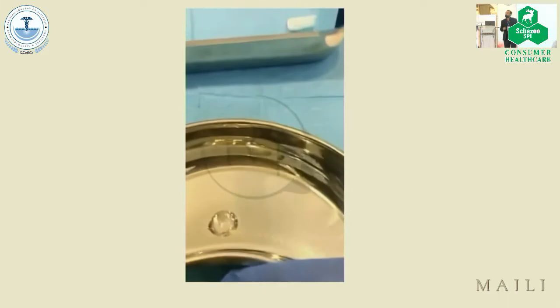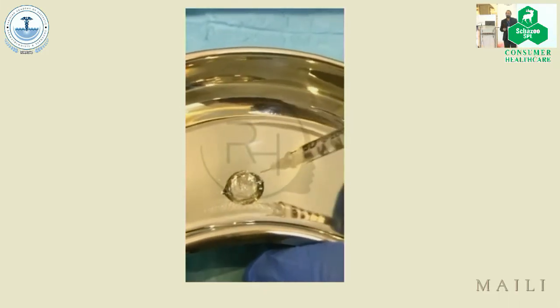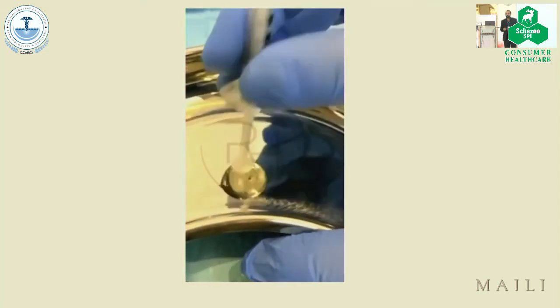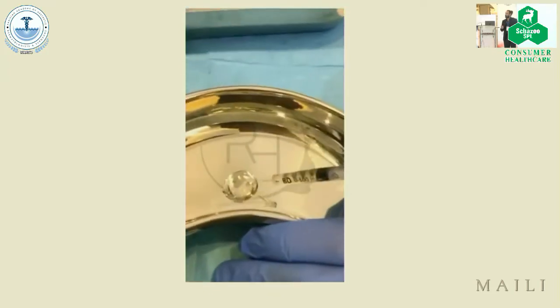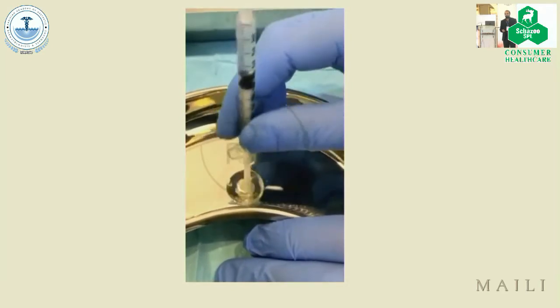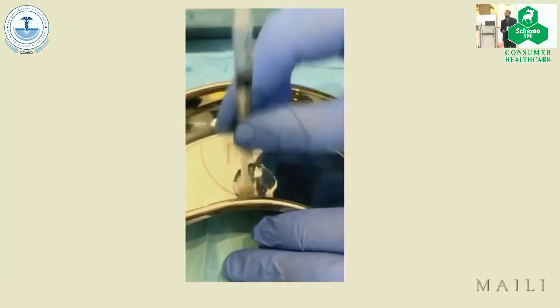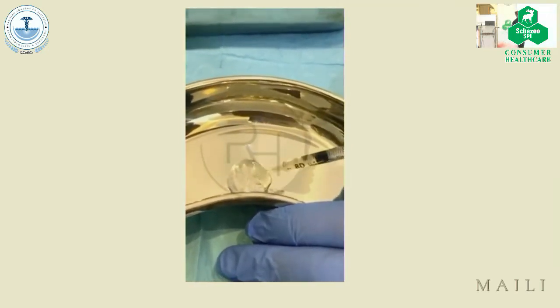So in order to dissolve it rapidly, what you need to do is not only inject hyaluronidase, but massage it, to make sure you press, to make sure it goes through and you get rid of all those particles. And with a bit of massaging and injecting hyaluronidase, you get rid of the hyaluronic acid straight away. So it's all about knowing how to use hyaluronidase, not only having it in your clinic.